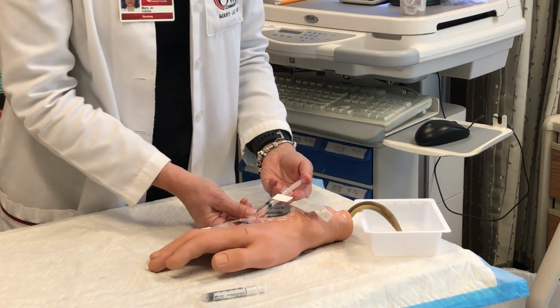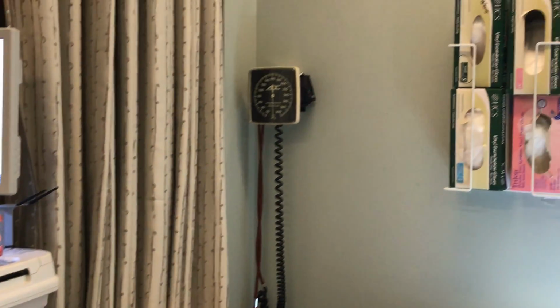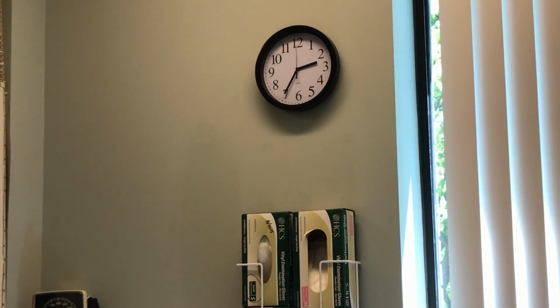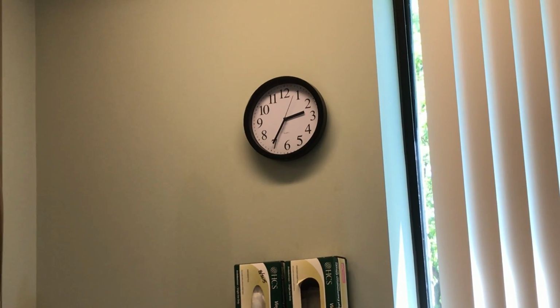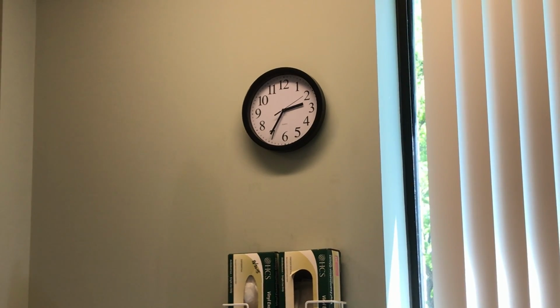I'm going to count 0.1, 0.2, 0.3, 0.4, and now wait 30 seconds. As I'm waiting the 30 seconds, I'm noting my patient's condition, assessing the site, making sure she's not experiencing any discomfort or any type of side effect.